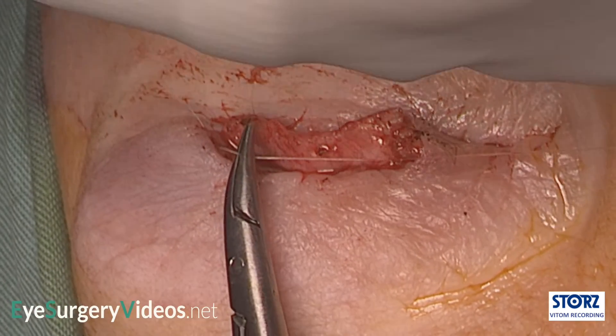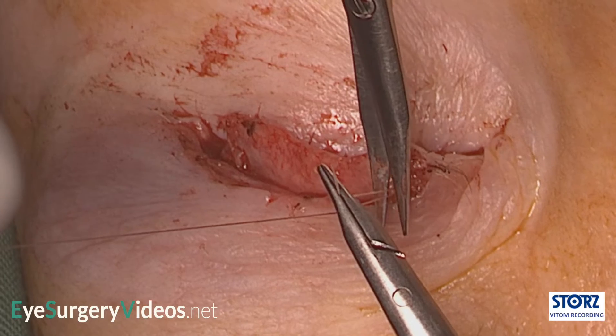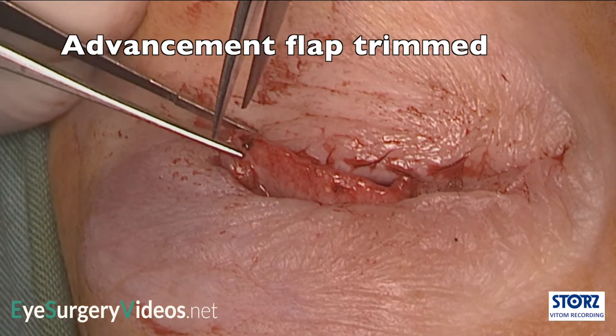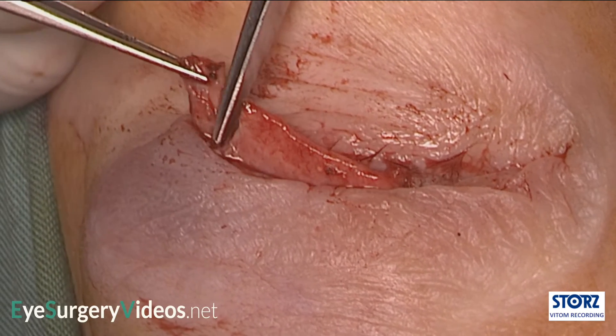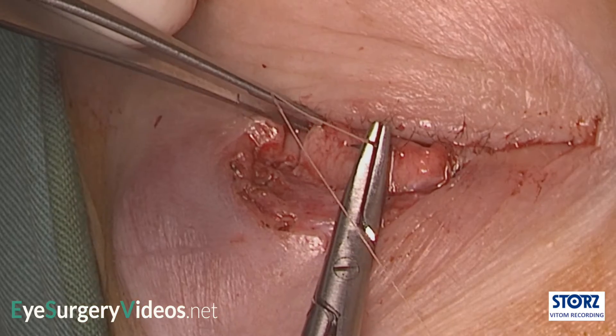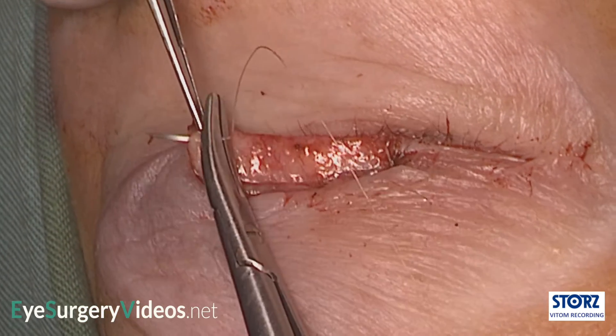The advancement flap should have a little horizontal tension to keep the upper lid architecture and contour. In this case it is a little too wide, so is trimmed. The other side is then sutured to the host tarsus.